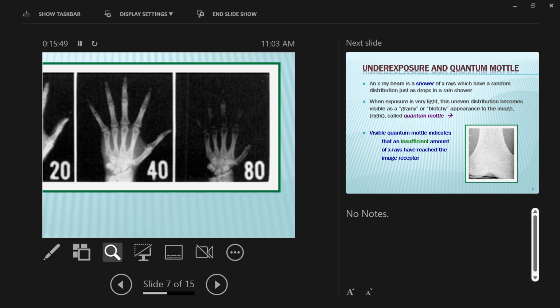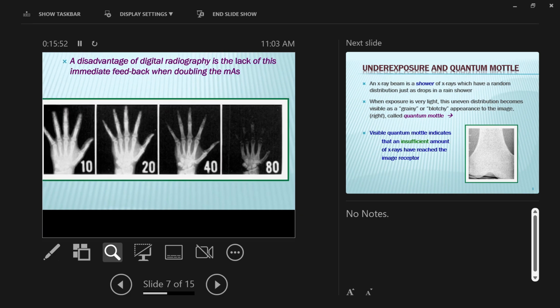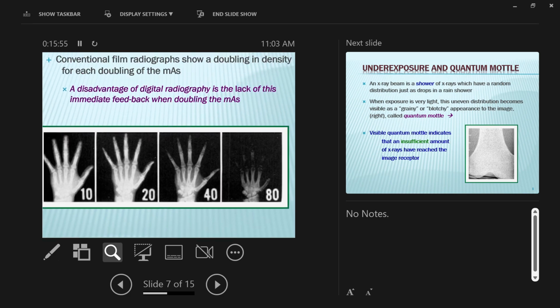We had to go from 10 mAs all the way to 80 mAs. So 10 mAs was sufficiently underexposed to say we have loss of visibility due to too much brightness. And 80 mAs was a loss of visibility due to not enough brightness, too much density. Brightness and density are opposites of each other.